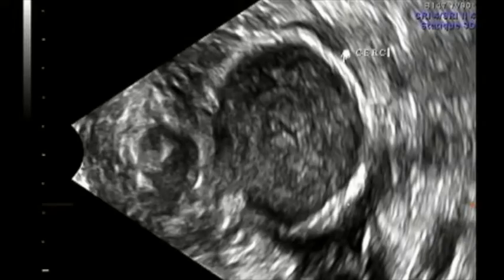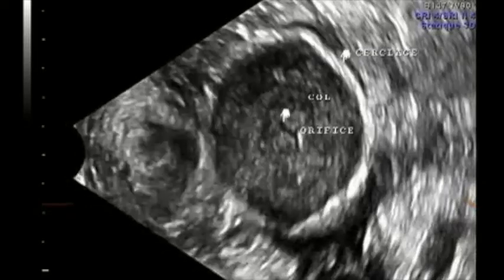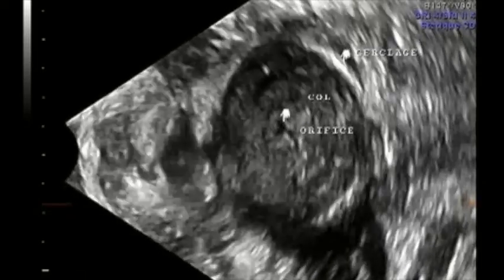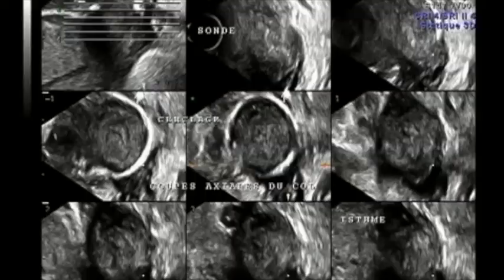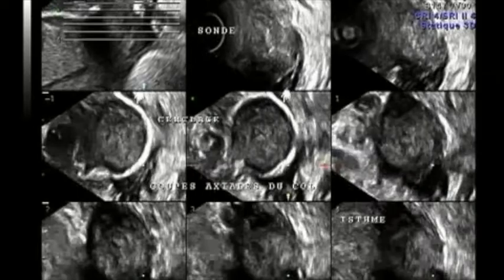On the treated ultrasound pictures, the cerclage, the cervix, and the cervical orifice can usually be spotted. As we can see dynamically, pressure on the uterine fundus does not in any way modify the opening of the cervix, and there is no modification of the external orifice of the cervix.